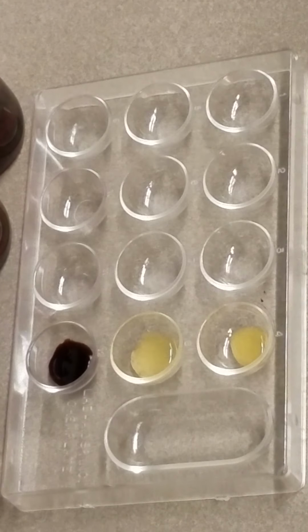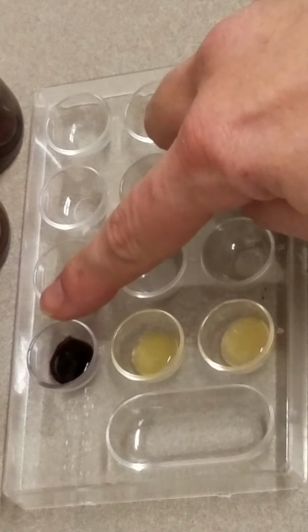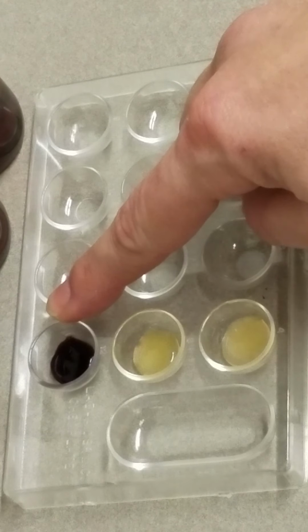Now I'm going to add RH, my anti-RH, and I know it's a little hard to see with the video, but I do have a reaction that has occurred. I have a little bit of clumping, a little bit of settling out that's occurring in the well plate. So with my A positive blood, I had a positive reaction with the anti-A, a negative reaction with the anti-B, and a positive reaction with the anti-RH. So what that tells me is that I do in fact have A positive blood.